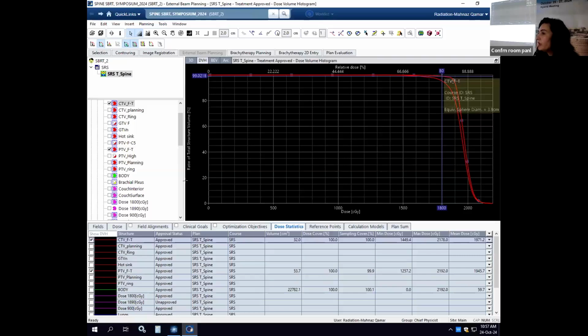So Mr. Zishan, he's our lead therapist. He brings a very good point. And like I said, this starts from the quality assurance part of the planning process, starts from the MDT, and the technologist in the CT room plays a big part. And basically, another very important criteria is the selection of the patient. What kind of breathing pattern, because every patient is going to be different. Not everyone is going to have a stable breathing pattern. So we have to select.